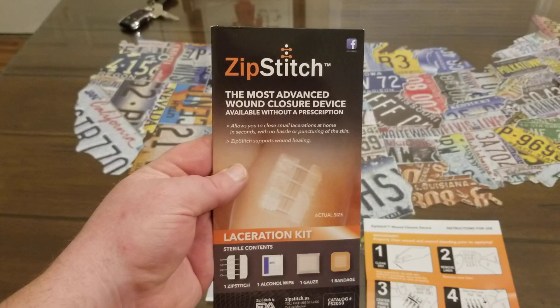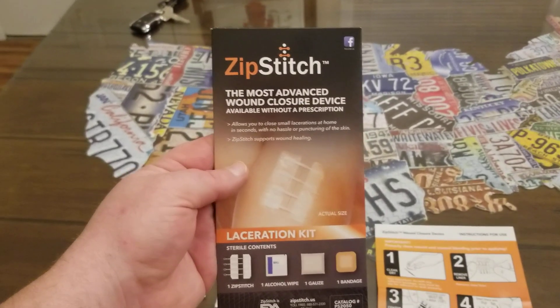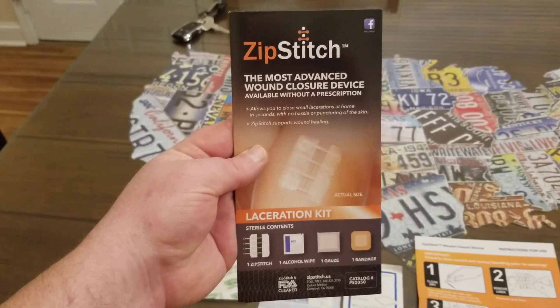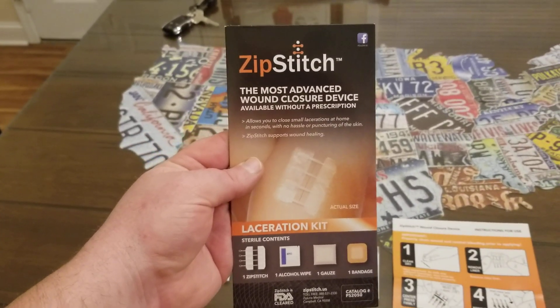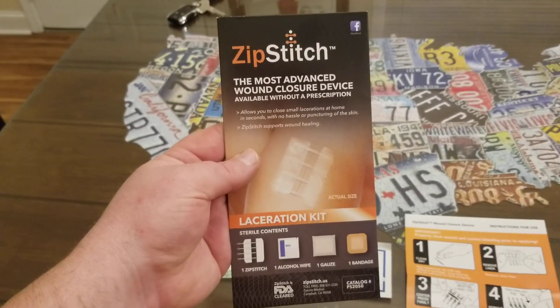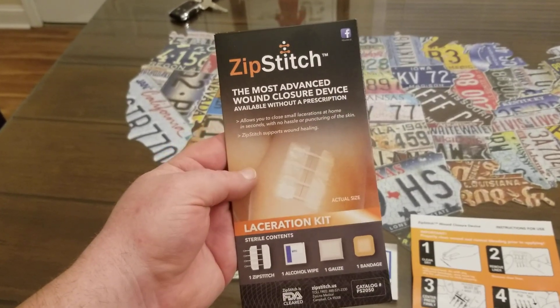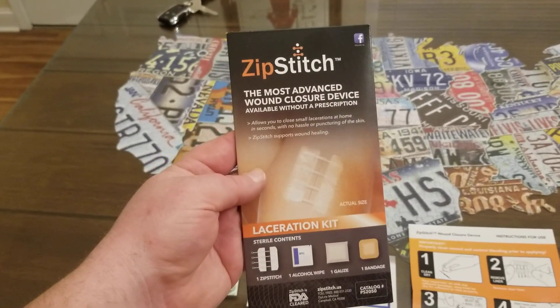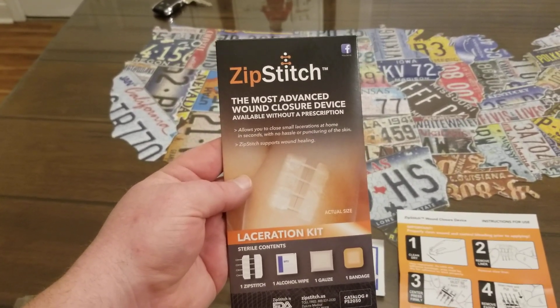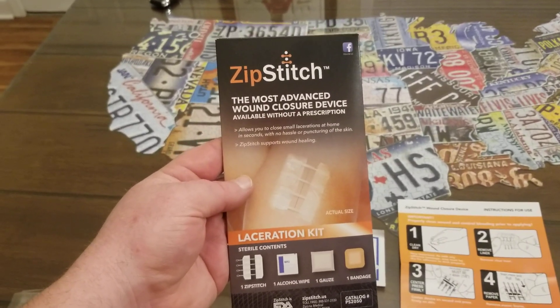I think it's a great product. I've never used it personally, but I read most of the reviews on their website — they had 15 five-star reviews — and on Amazon they had around 370 reviews at four and a half stars. So it works pretty well. I also looked at some pictures online where people had accidents and used this product, and it healed up nicely.